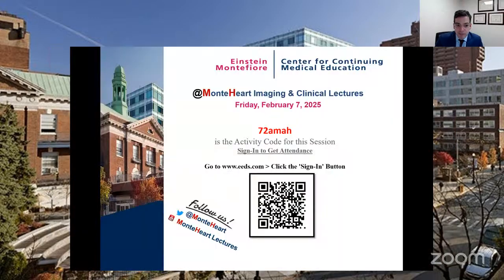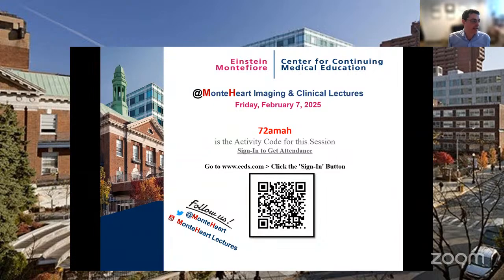Thank you very much. There was one other good question in the chat, from Danielle: have you tested it for detecting left main disease, which is the classic Achilles heel? In that work by Evan Eisenberg, she did look specifically at left main disease, and it does help you identify it, but realistically, SPECT isn't going to catch all balanced ischemia. There are inherent flaws to the technique, and AI can't get rid of some of these inherent flaws.